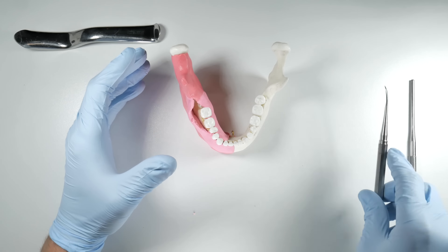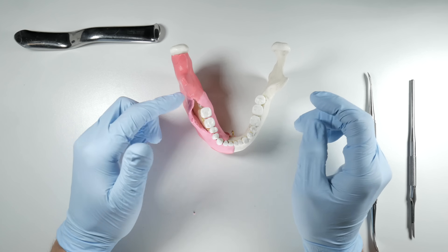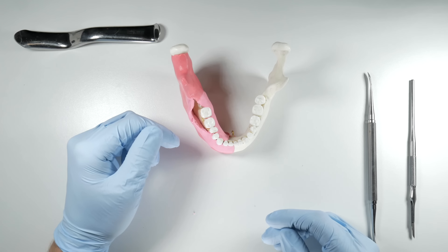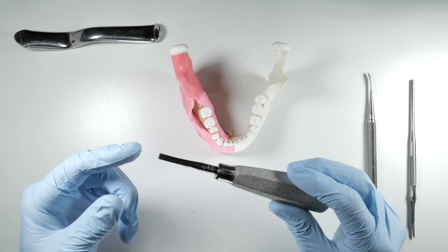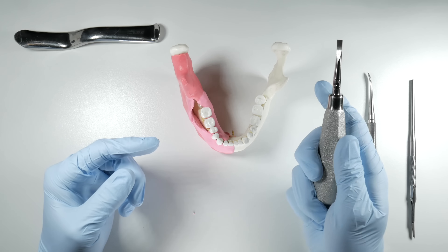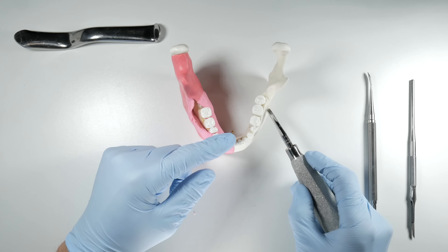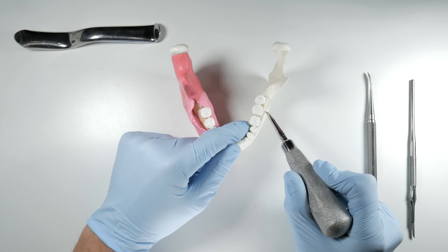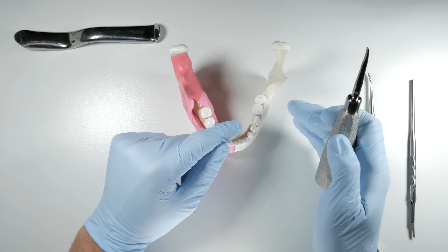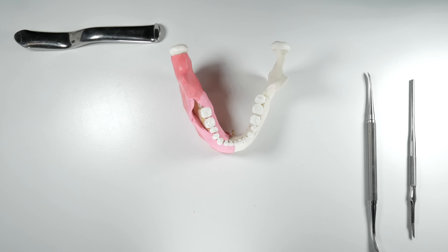Take your time and do this step properly. Sometimes the distal part is tough to get fully open because it's very fibrous back there — if that's the case, complete it with sharp scissors: just get in there, snip it, and you're good to go. Another helpful instrument, particularly for a triangular flap, is a 69W chisel — it has a handle like an elevator with a flat broad end and a sharp tip. For a triangular incision, you put it into the vertical portion on the bone, push down, slide it back, and it pushes all that tissue off the bone, giving you a nice reveal of the tooth.